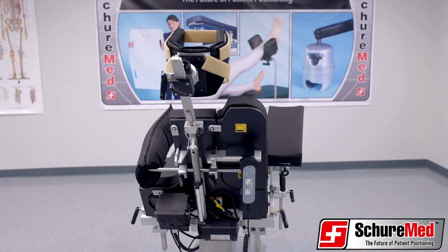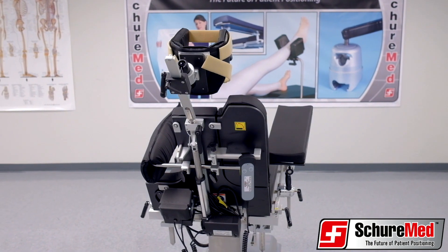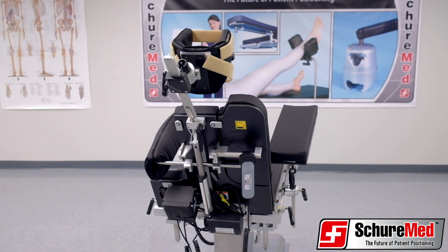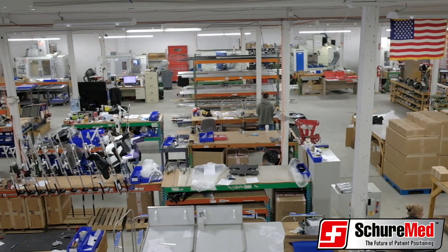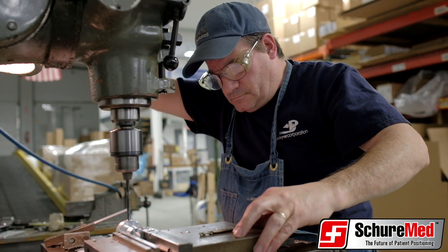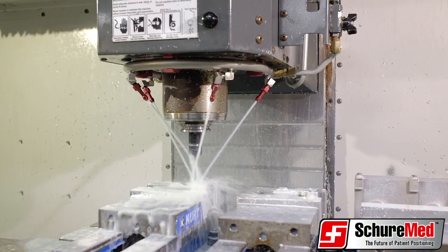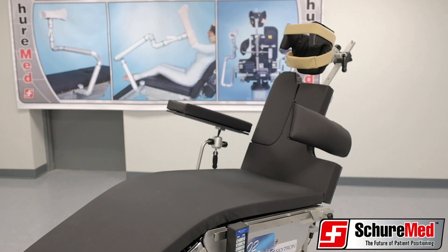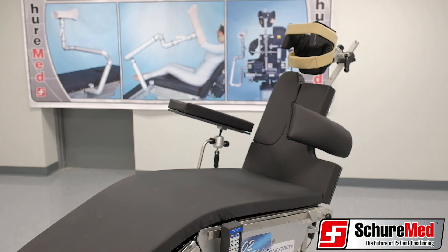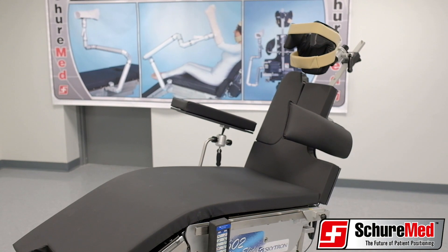The powered beach chair and manual version are the gold standard for surgical shoulder procedures. The beach chair is designed and manufactured at SchureMed's world-class facilities here in the United States, and has been designed to increase surgical performance while maximizing patient safety.